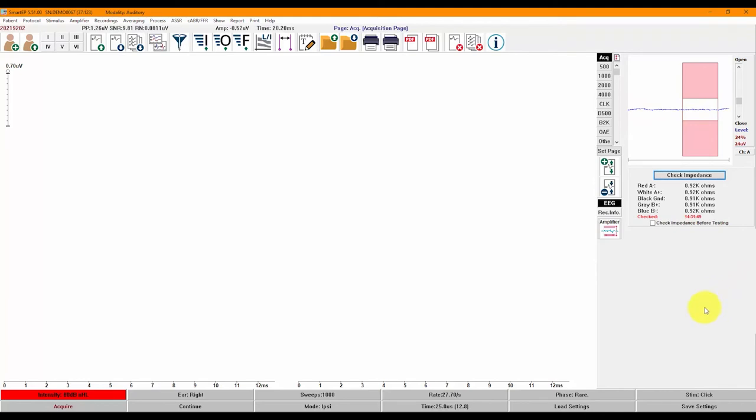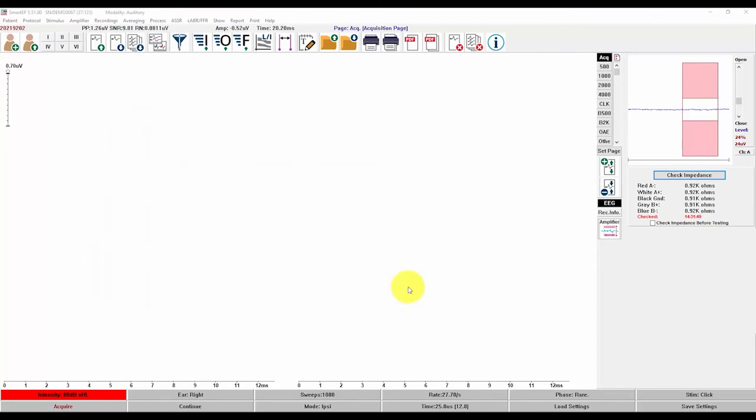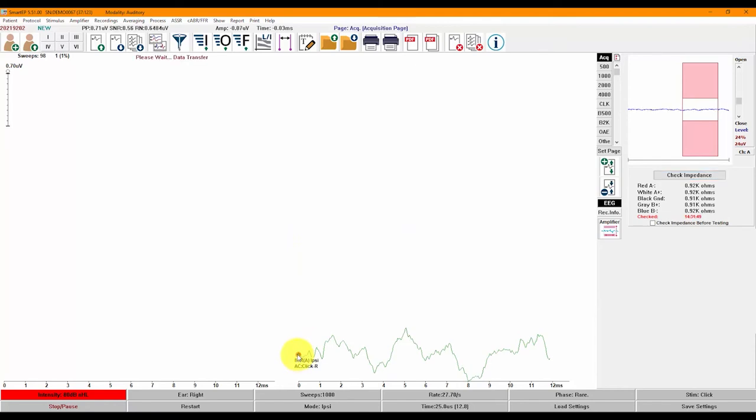Now I'll click on Load Settings and select my Click ABR settings file, and I'm ready to begin. I set my intensity to 80 and click on Acquire. To select a waveform, you can click on the waveform or on the circle on the left of the waveform. Once selected, you can move it up and down the screen by dragging it or using the up and down arrow keys. During acquisition, the number of sweeps will appear on the top left with the number of rejections next to it. You can label the peaks at any time during or after acquisition and even work on one waveform while acquiring another.